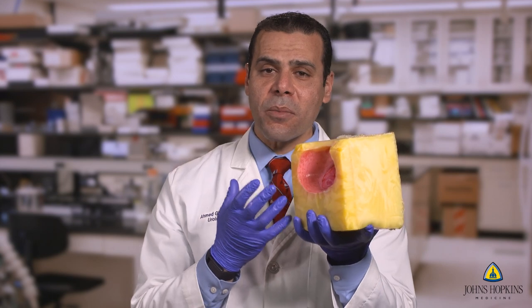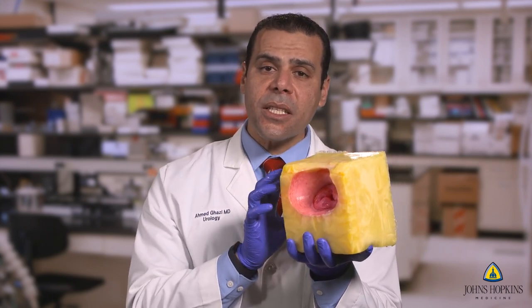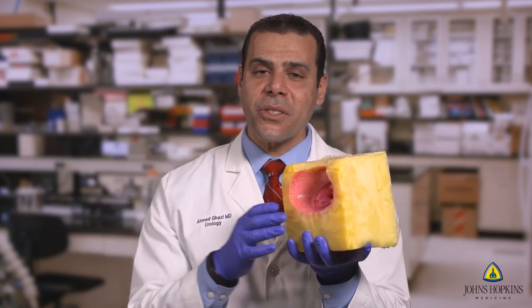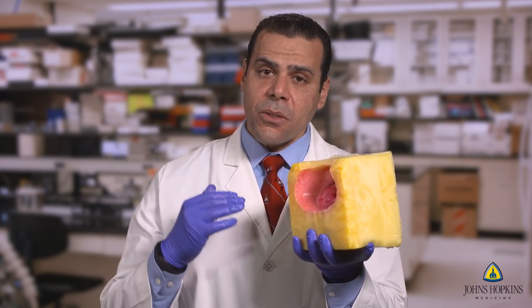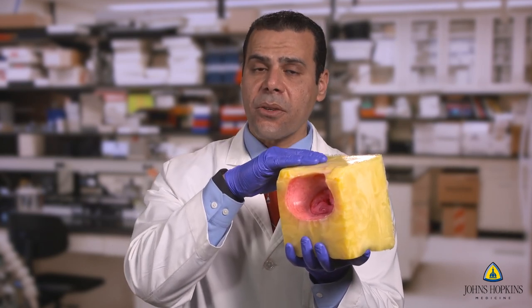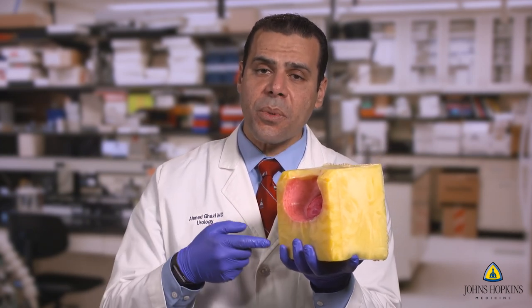This model alone makes no sense unless we place it in a casing that allows us to actually be able to practice the procedure, and this is where the true genius of our engineers came in. We were able to create a self-irrigation system with three components: an insert that's all hydrogel and is very realistic, a top component that houses the insert and matches to another half of the 3D-printed bladder, and then a reservoir that contains a pump that is able to circulate the fluid through the scope and the entire procedure without leaking whatsoever.